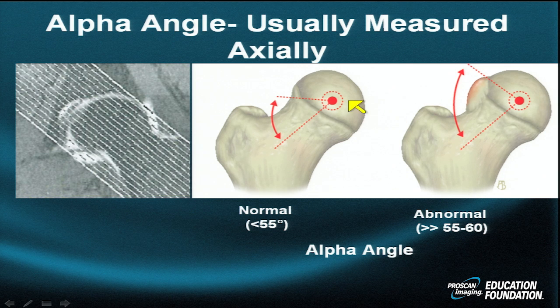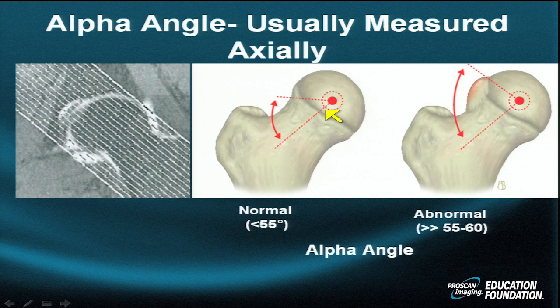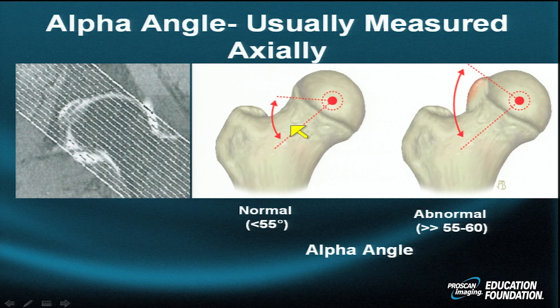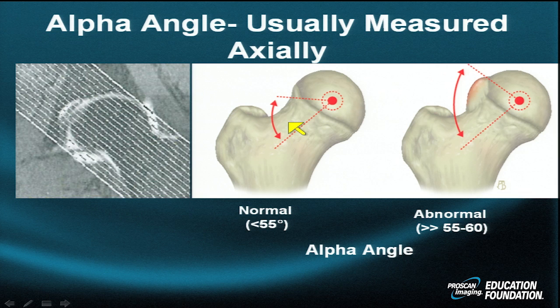Here's a coronal with a slight oblique — a paracoronal — catching the long axis of the neck, intertrochanteric structures, and head simultaneously. Here too we can bisect the femur from the center of the femoral head, with D divided by 2 equal on both sides, and draw our transition point between the head and the neck. The angle is less than 55 degrees in the normal state; with a bump, the angle is well over 55 degrees in a patient with cam type FAI.